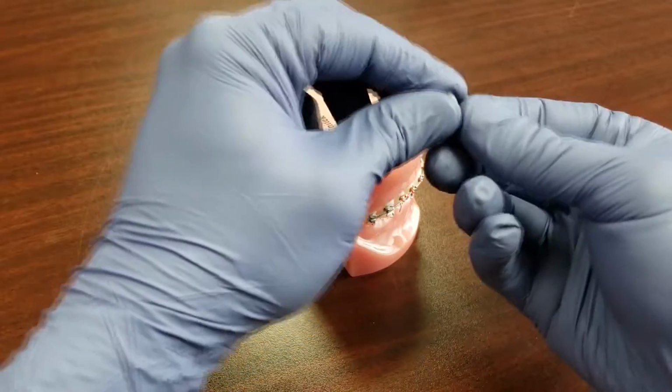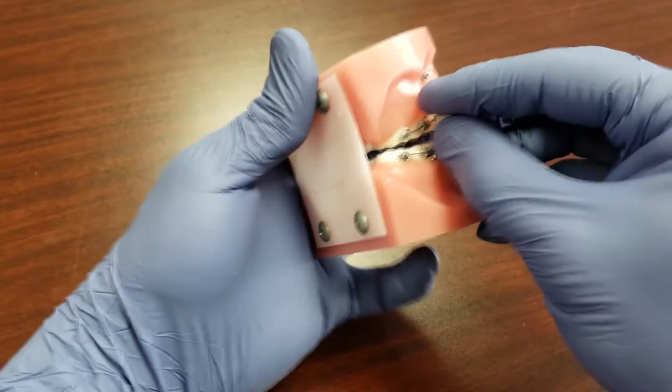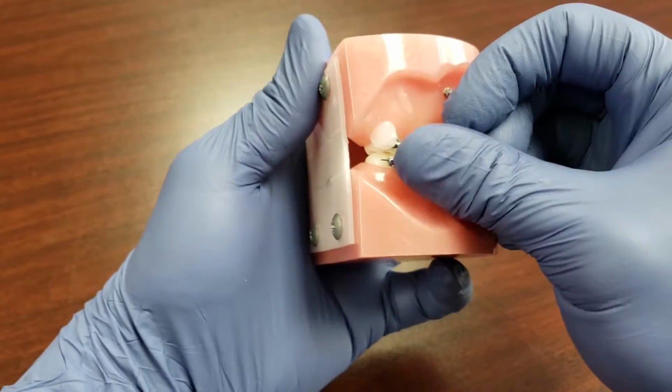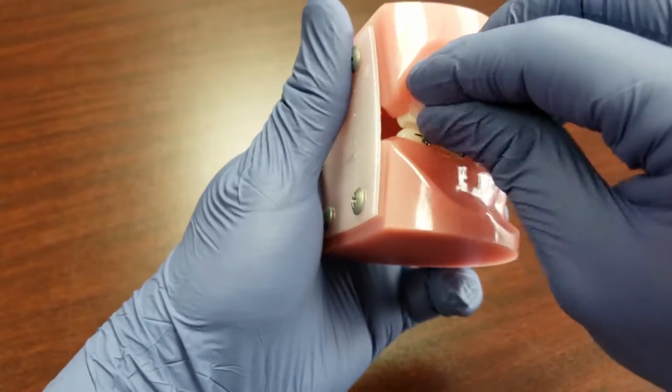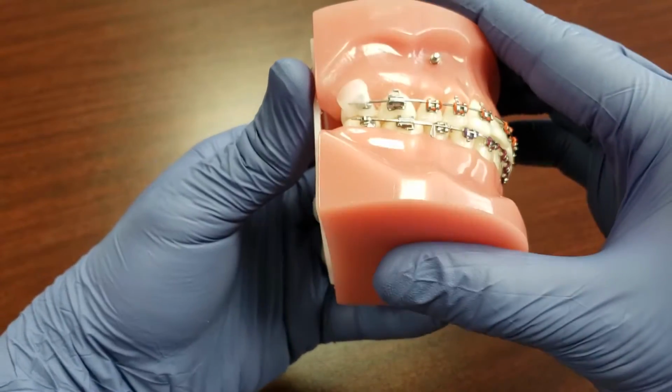The next thing you've got to do is smush it around like this, get it kind of warm, and then take that wax and kind of smush it up into a spot that's poking you like that. And don't be afraid to push it up in there, get it under the undercuts, and there you go. That's going to feel a whole lot better than a pokey wire.